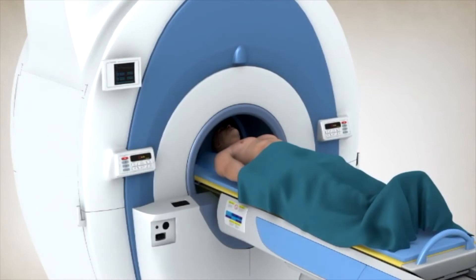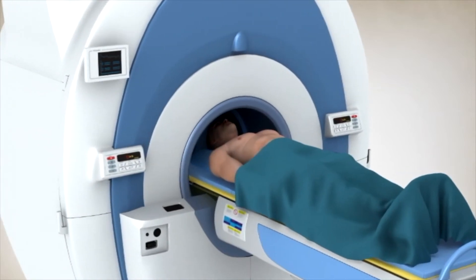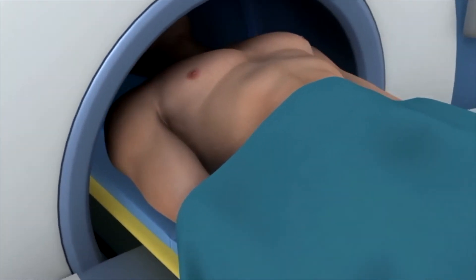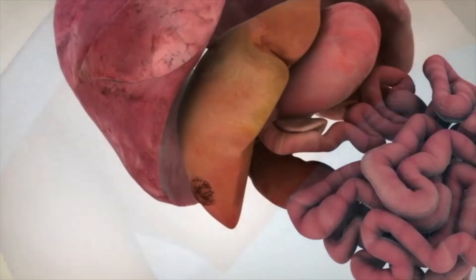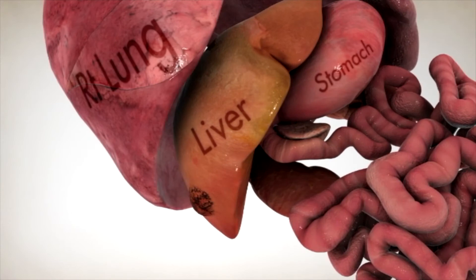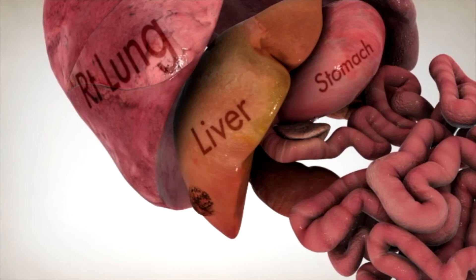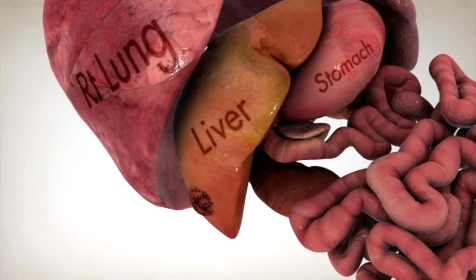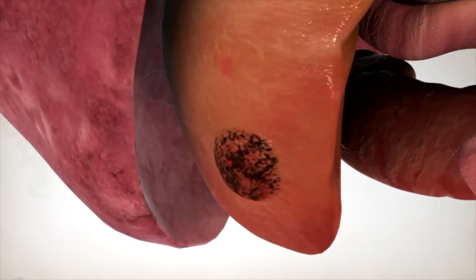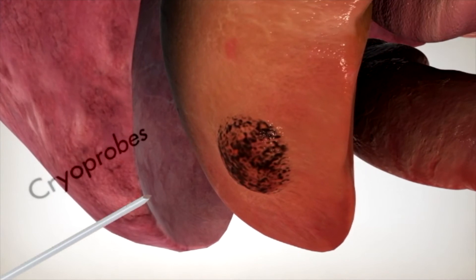For some cases such as liver metastases, the patient is positioned face up in the CT scanner. The area is viewed with the CT scanner and cryoprobes are inserted from the side or front of the body to ensure that they reach the tumor.